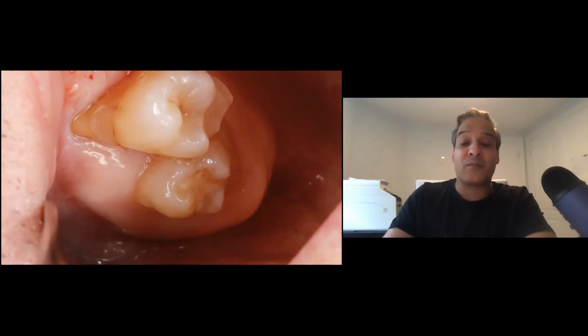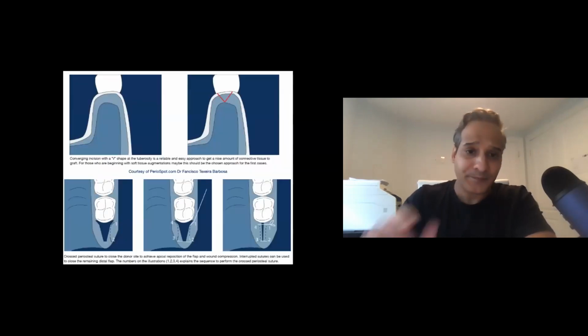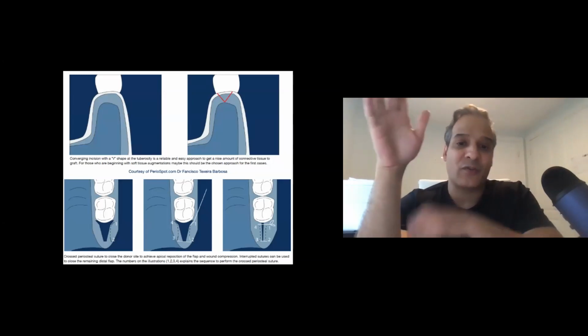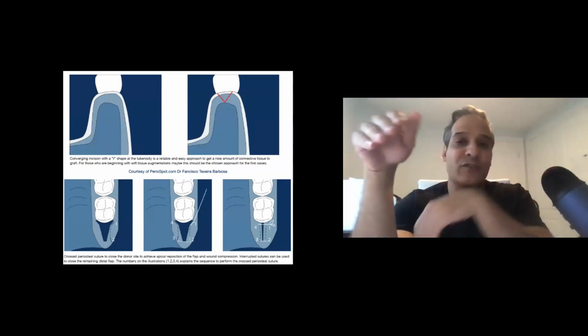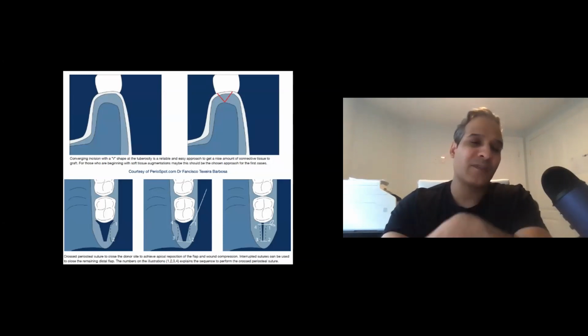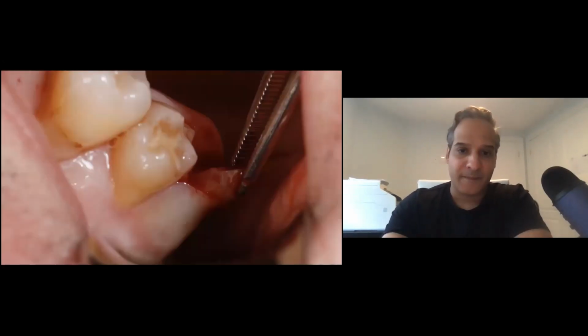really good thick tuberosities that you don't even need to go anywhere else in the palate, especially for just, you know, treating some recession. So the way it's taken is, you know, you can make a V-shaped incision, or you can make an incision and sort of peel back the flaps and then take a larger piece from underneath. And once it's removed, it almost comes out like a wedge. So if you see here, I just make my 2 parallel incisions, and then I kind of change my angle depending on how large or how thick I want my graft. And the graft is just pulled out and cut out.